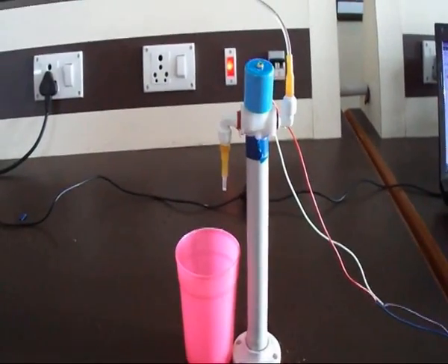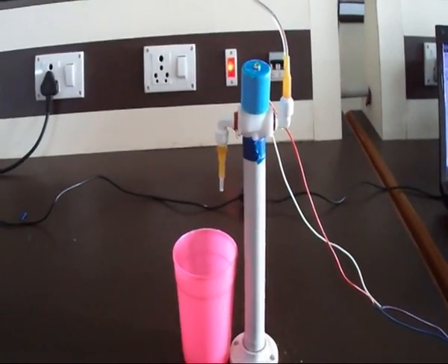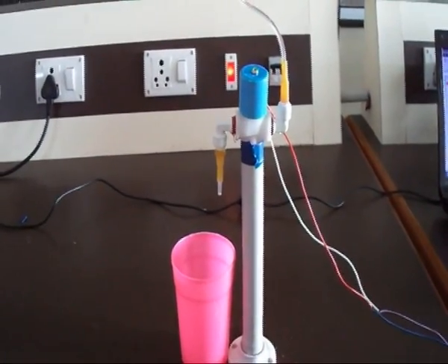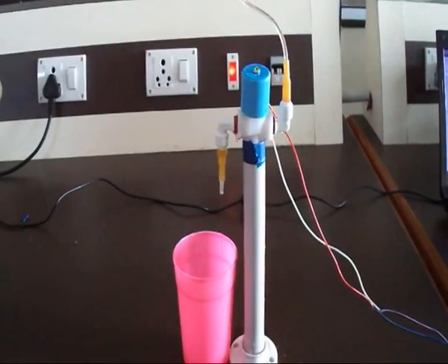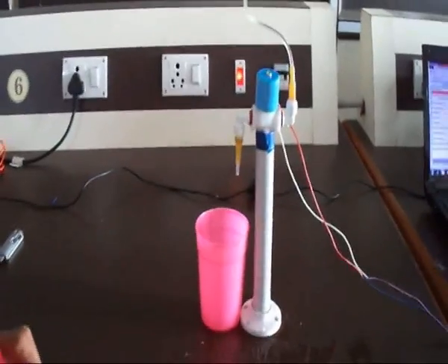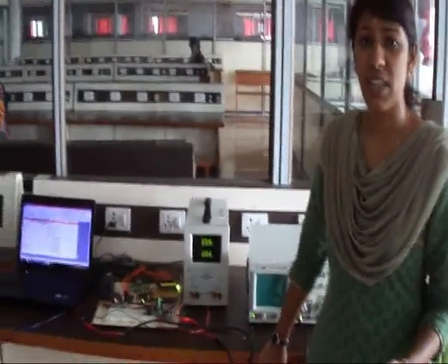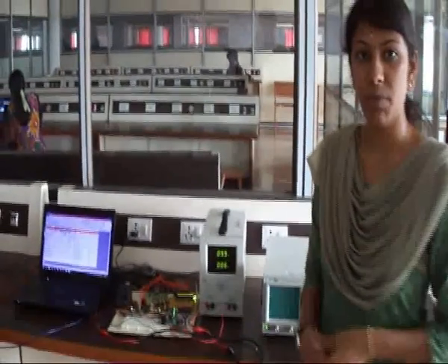Now the machine will be on for 1 second, and the flow of anesthesia will be injected into the patient's body, and will be off for 10 seconds. Thus, the patient is continuously monitored as well as anesthesia is injected into the body system. We can have control over the patient 24/7, and the doctor's required availability can also be reduced.